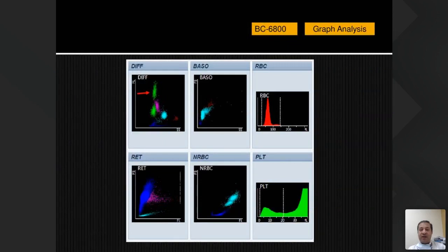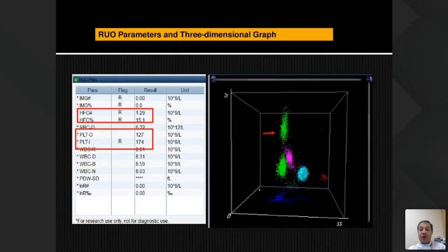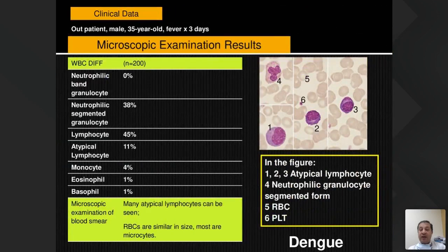And how does it come about? This is a very, very characteristic lymphocytic picture, a figure of eight picture that you get in this particular case. And the moment you find this kind of a picture, especially in a patient who is having febrile illness, you should be almost assured that this should be dengue. And again, just to show you how this looks very clearly, this is a case wherein you have dengue. And all these are these kind of plasmacytoid lymphocytes, or monocytoid lymphocytes, which you see in dengue, and you're able to pick them up from the peripheral blood.